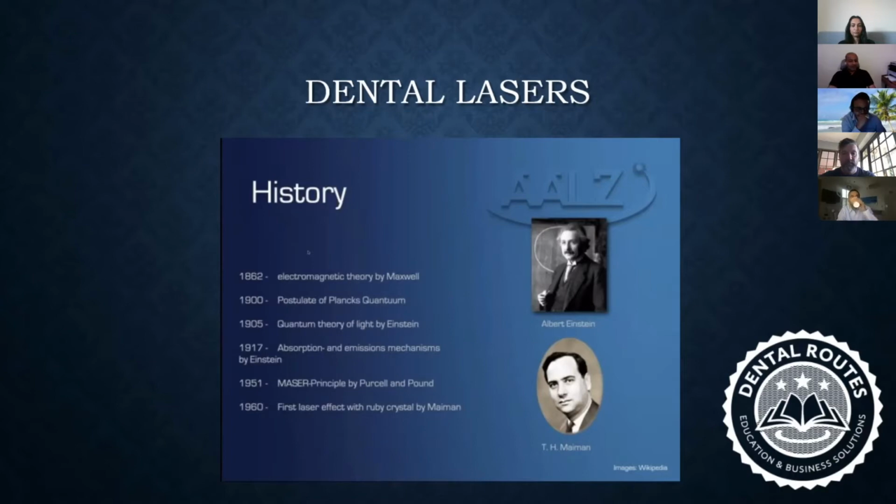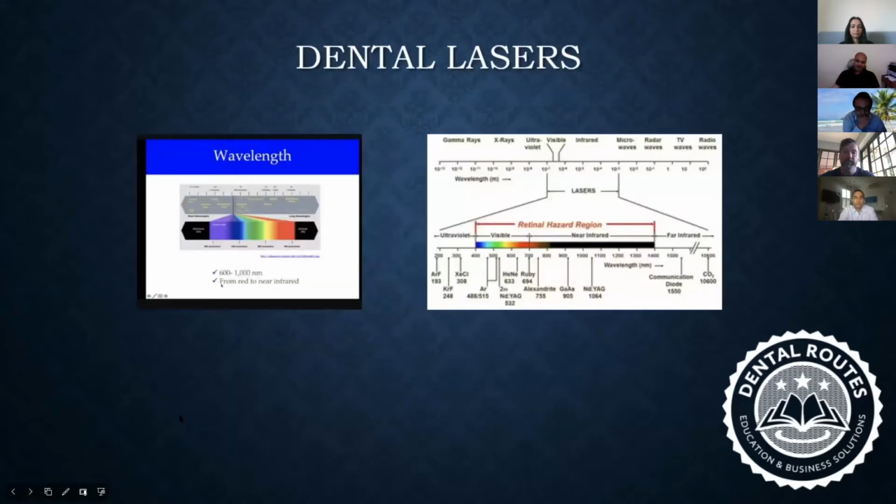A brief history, I would say, about how laser has come into existence and how laser has then slowly started to integrate itself into every aspect of medicine, be it ophthalmology, be it skincare, and now in dentistry. I don't know why, but it's a bit slow in dentistry. And our whole process is to see how we can make it more integrated into our day-to-day dental practice. And the whole webinar today was a discussion between us who are using dental lasers and people like Chris and Krishna, who've been looking into technology in dental implants and all other fields in dentistry.